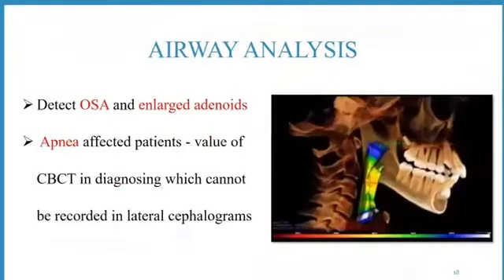Airway analysis. Conventional radiography and reconstructed 2D CBCT images provide similar assessment of the airway. In comparison, axial cuts of 3D CBCT scans provide soft tissue points that are derived from the projection of the shaded areas, which are more clearly visible in the axial CBCT cuts compared with conventional radiographs, thereby enhancing the airway assessment. This was stated by Bozzotto et al. in 2012.